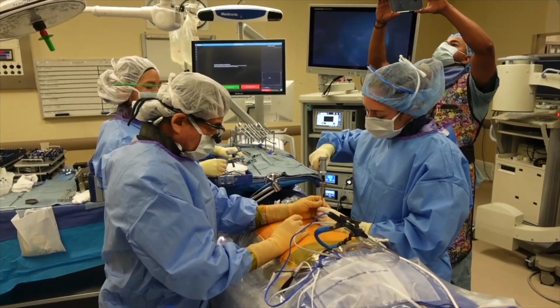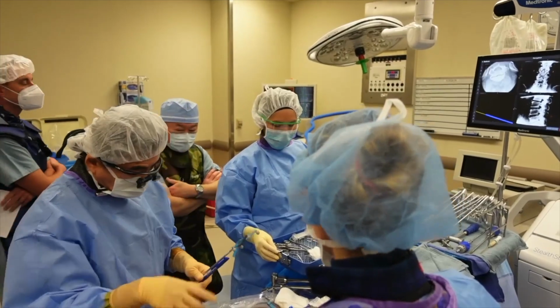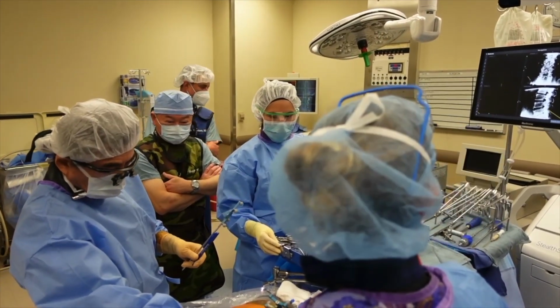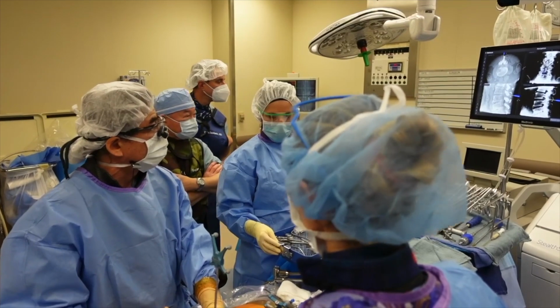All right, putting in the PSIS patient reference pin. All right, we're about to get started. We have the patient reference pin in, very solid because he's young and has good bone. I'm going to use the nav dilator to map out where everything is before I make the incision.